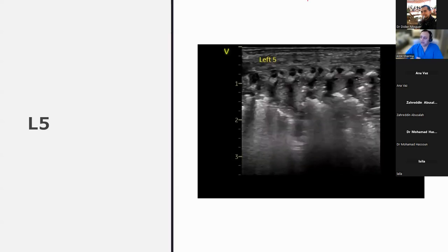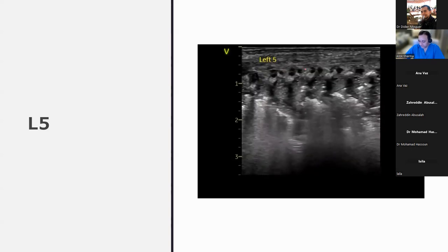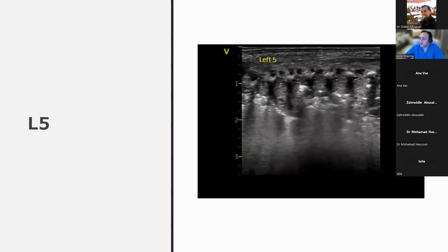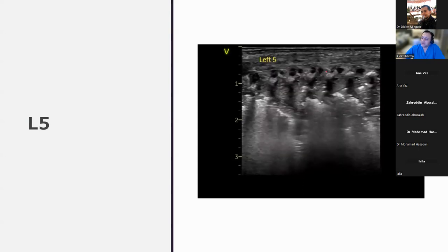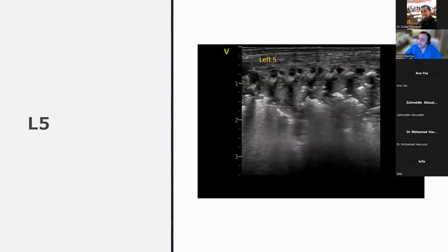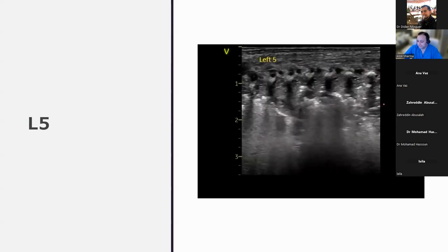Yep. So again, putting Doppler over here didn't give me any particular kind of blood vessel changes. But you see this large hypoechoic area with static air bronchograms. So really what you're seeing is aeration probably coming up to this margin over here, but no aeration because there's no distal pleura. So these are the ribs. And really the confusion that you'd have is I can't actually see a proper bat wing sign, but that's because the whole of the lung on this side in L5 is atelectatic.